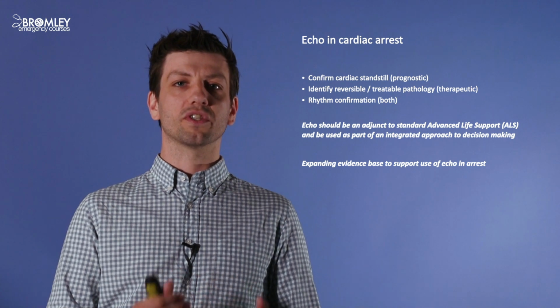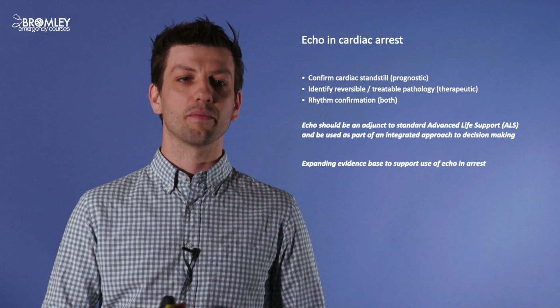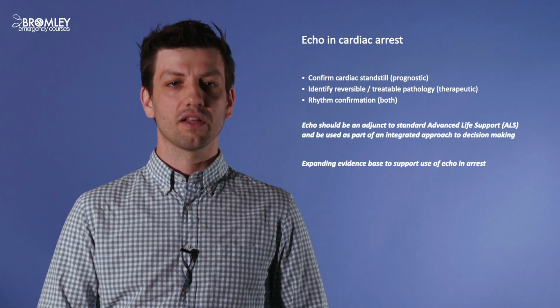I think it's important to stress at this point that the evidence for echo in cardiac arrest is limited, but it is expanding. At the moment we should be using it as an adjunct to advanced life support, and we should be using the findings from our echocardiogram as part of an integrated approach to treating these patients.